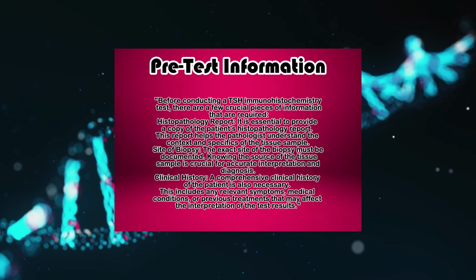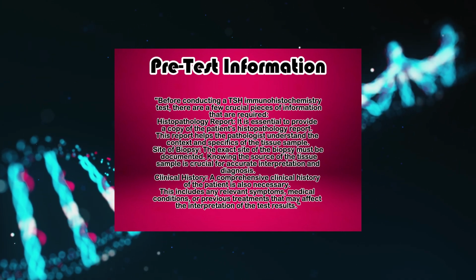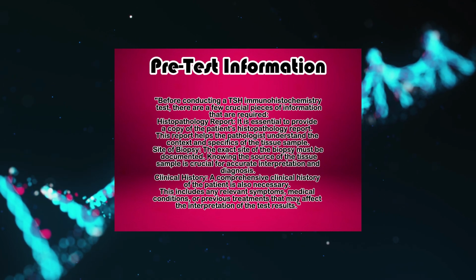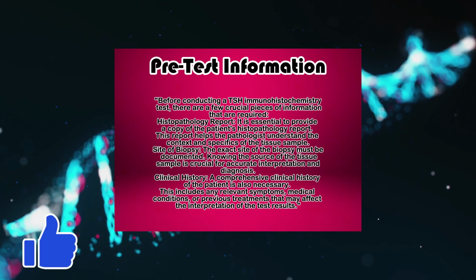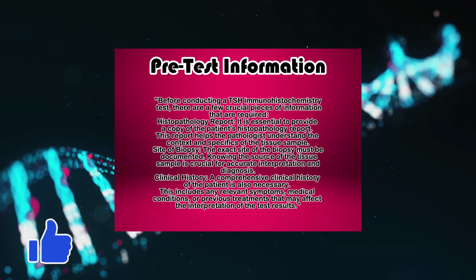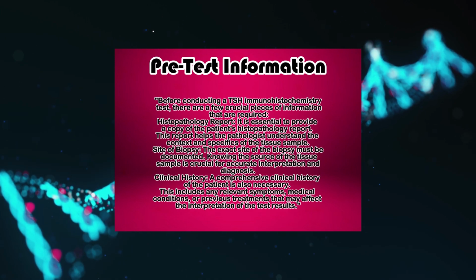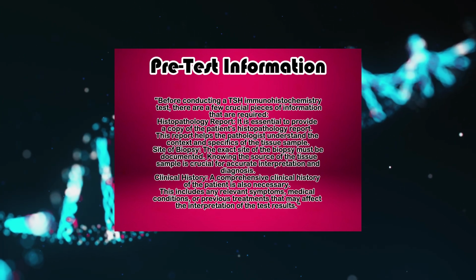Site of biopsy. The exact site of the biopsy must be documented. Knowing the source of the tissue sample is crucial for accurate interpretation and diagnosis. Clinical history. A comprehensive clinical history of the patient is also necessary. This includes any relevant symptoms, medical conditions, or previous treatments that may affect the interpretation of the test results.